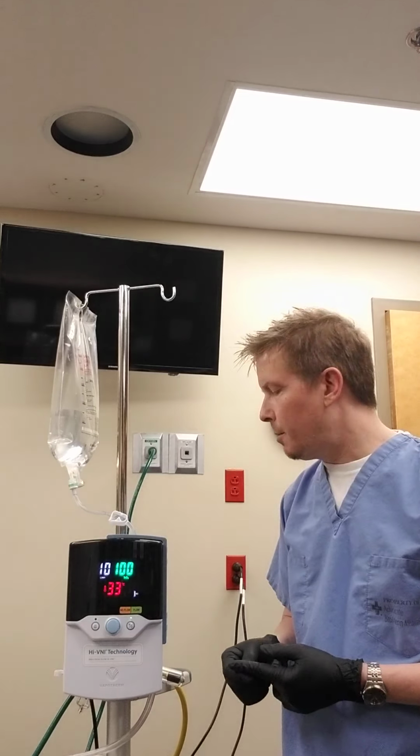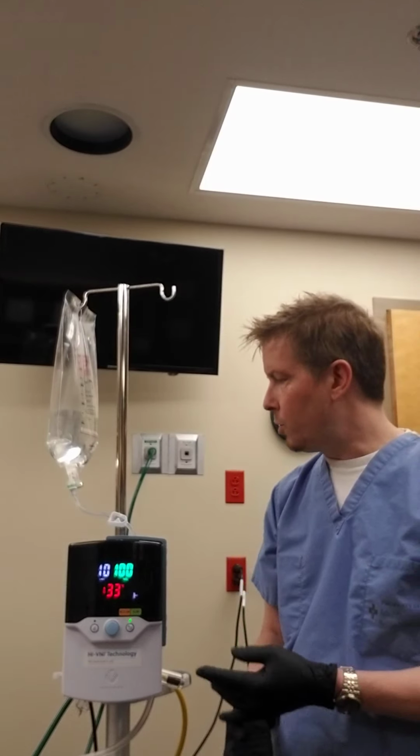This is going to be a quick tutorial on heated high flow nasal cannula oxygen as this pertains to our facility. We have actually dabbled in heated high flow nasal cannula oxygen for years and years, well over a decade. We used to use an older system. It was a Fisher-Paykel system. It was very noisy and decently efficient. But in the past few years, through a significant amount of research, we have discovered this unit, which is the Vapotherm, which is a heated high flow system. It's very quiet. It's incredibly efficacious and very effective, especially with our COVID population of patients who are hypoxemic.